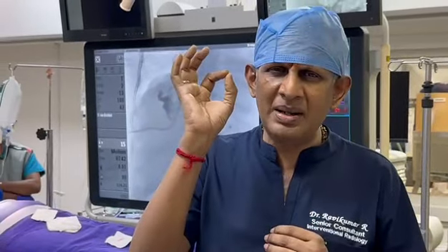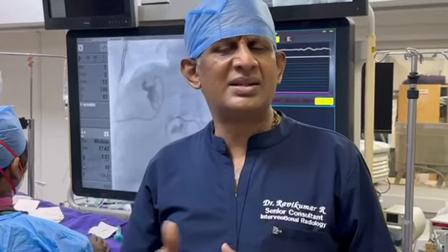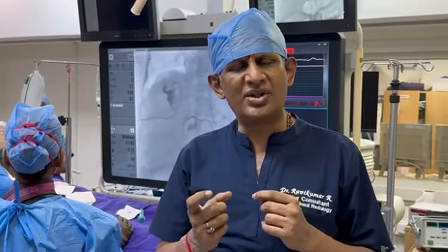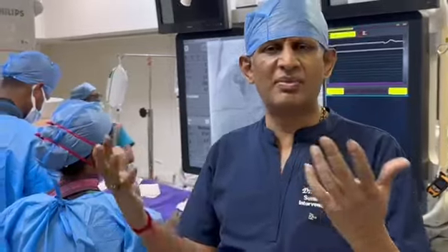Once you're suspecting an infection, never inject volumes of contrast. Just inject a minimal amount of contrast. Once you see the candlestick appearance, you directly put the wire and try to get to the drainage system. And the last, not the least, is once you have achieved a good drainage system, you need to make sure that the catheter is nicely secured, because you've got locking systems and you've got free drainage systems, and depending on that, on the infectious part, you can choose whatever size.